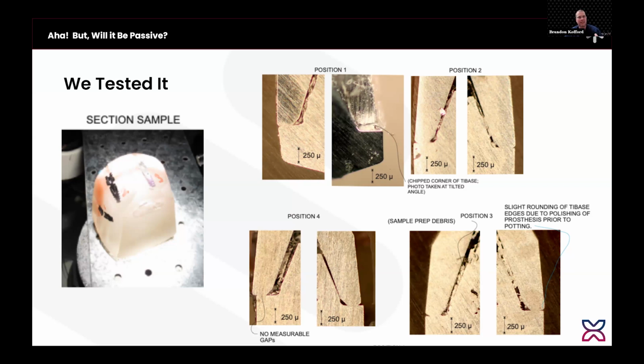But we tested the passivity of fit. I made a model with implants. Then I put abutments in the implants. Then I made a prosthesis on those abutments. Then I removed the prosthesis. I removed all 4 of the abutments. I shook the abutments in my hand.